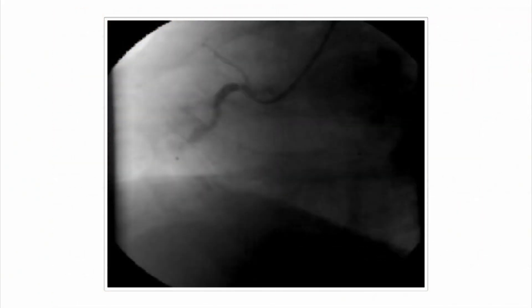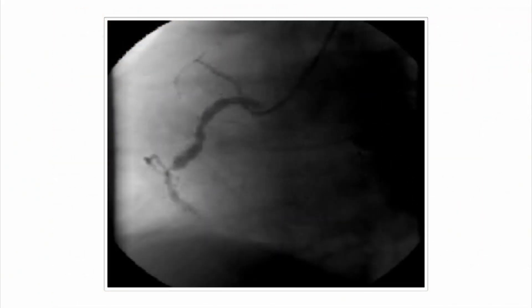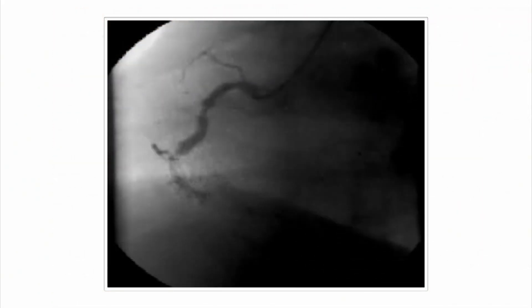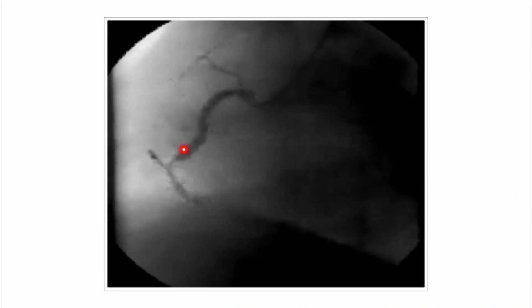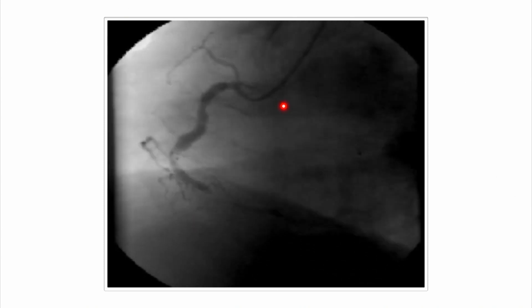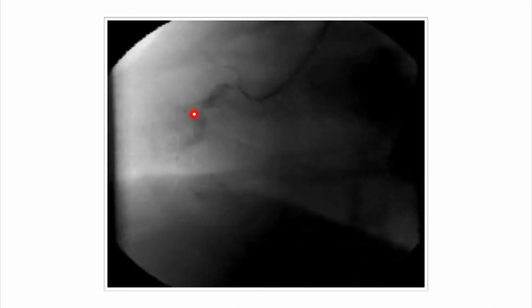We have an angiogram of the patient where the right coronary artery looks really ugly. We have an occluded right coronary artery and diffuse abnormalities here.